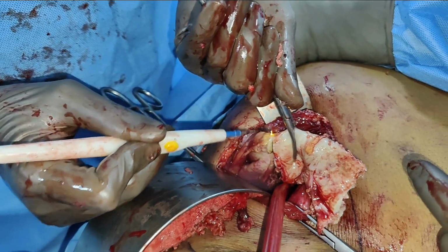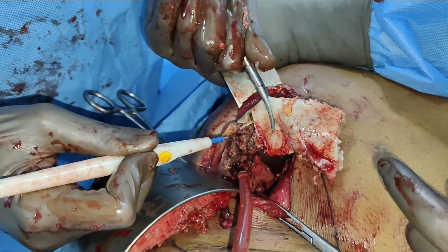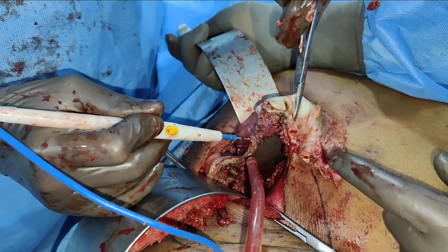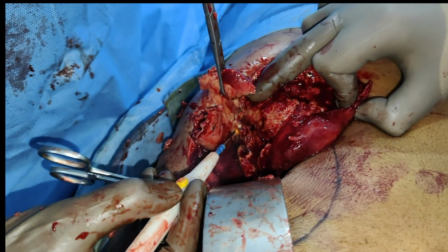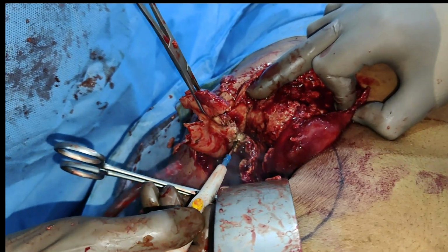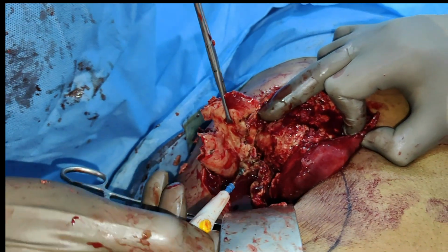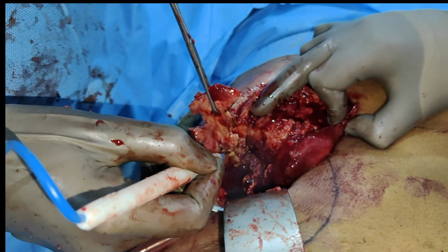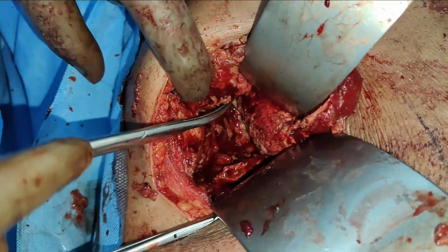Once this deroofing was done, the cyst cavity was given a copious lavage with normal saline, and after complete wash, we packed the cyst cavity with the omentum. The hemorrhage or oozing along the cut margin of the cyst was taken care of by using PDS or Prolene 2-0 suture. A continuous Prolene 2-0 suture was taken along the edge of the deroofing margin so that the bleeding is completely taken care of. Here you can see the complete cyst which is deroofed.